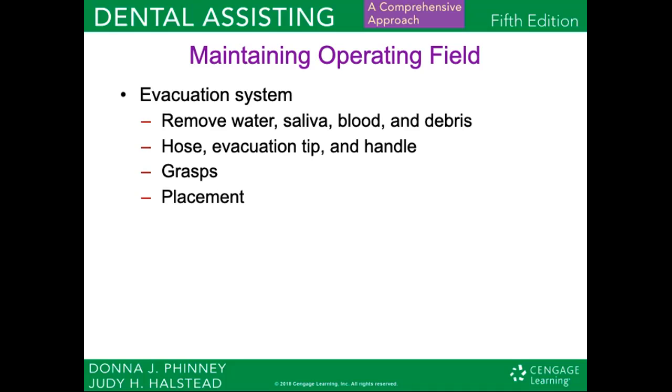But also, because the evacuation system is so strong and forceful, it's very easy to suck up patients' tongues or cheeks, or even your doctor's finger. So you want to make sure that you're holding it correctly and that you're placing it in the mouth correctly.